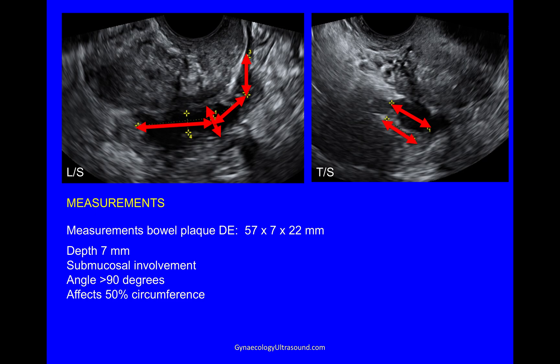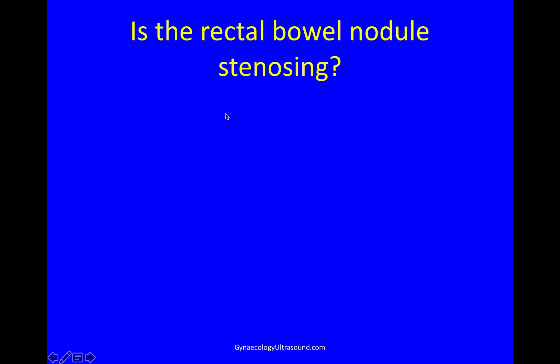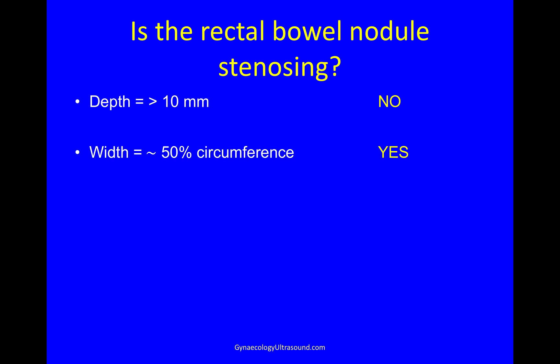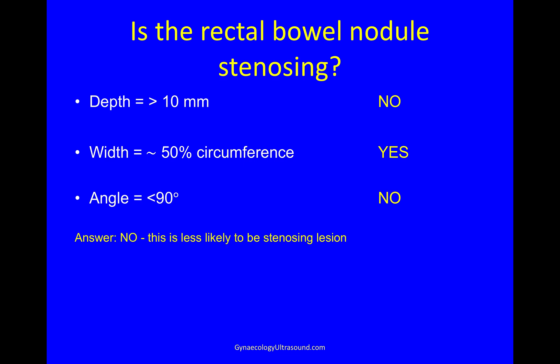There's the width and there is the diameter of the bowel. You can see that that covers the entire surface of the bowel — so half of the circumference. There is some submucosal involvement, though it's not very clear in this image. The bowel angle is more than 90 degrees. So if we think about whether this bowel nodule is stenosing or not: it's not more than 10 millimetres in depth, it does cover half of the circumference, and it doesn't retract the bowel into an angle of less than 90 degrees. So I think this is less likely to be a stenosing lesion. When the deep endometriosis is as linear as that, I tend to call it a plaque rather than a nodule because it describes it better.